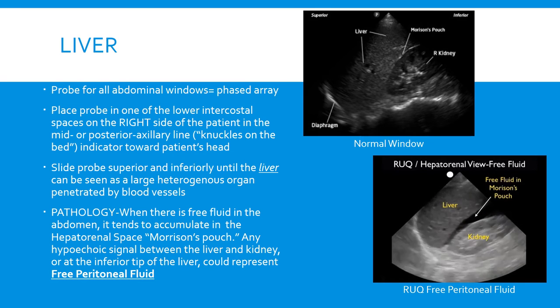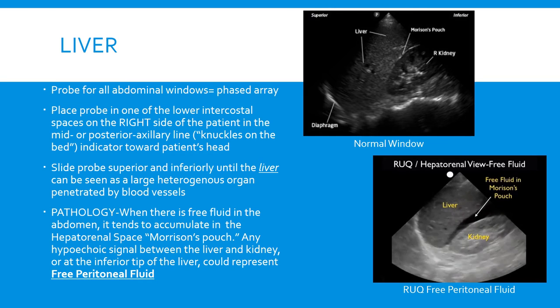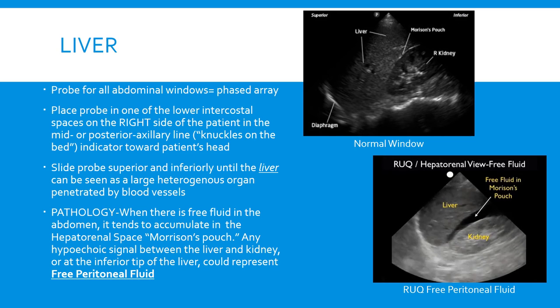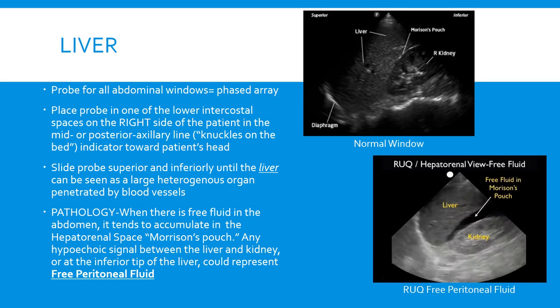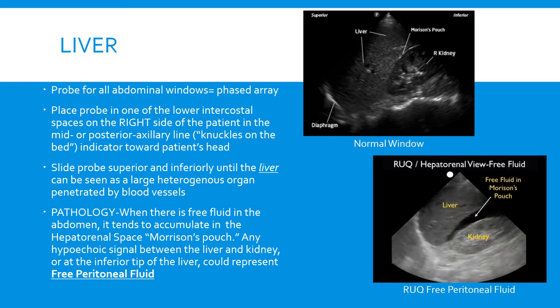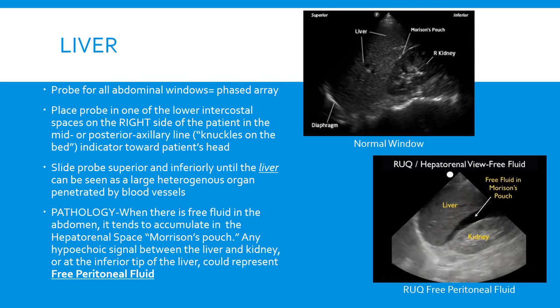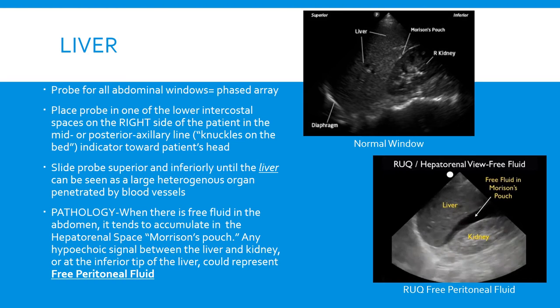The first thing we're going to look at is the liver, seen as a large heterogeneous organ penetrated by blood vessels. You'll see the kidney abutting it inferiorly, and in between the liver and kidney is an area called Morrison's pouch. When there's free fluid in the abdomen it tends to accumulate here. Fluid will first accumulate around the tip of the liver, and as more accumulates you'll see a separation with a hypoechoic signal between the liver and the kidney.